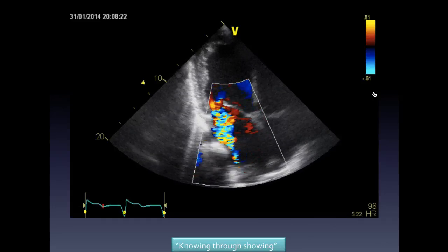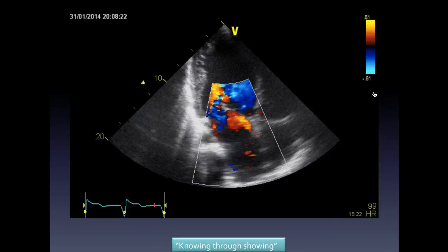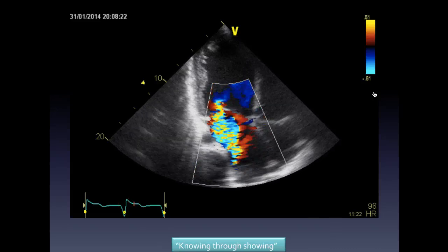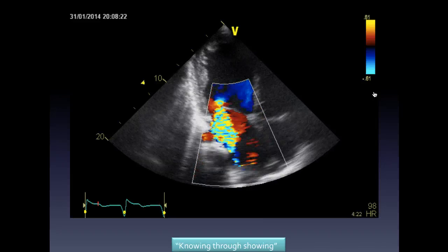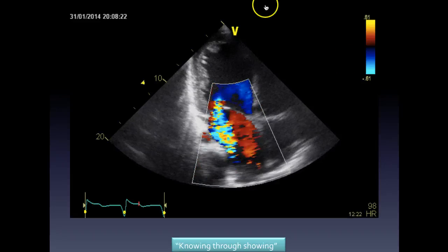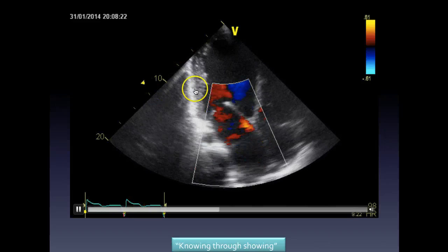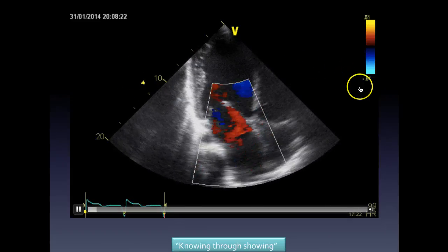And the pulse repetition frequency is generally set automatically by the machine based on the frequency of the transducer probe and, to a certain extent, the distance of the probe to the area of interest. And the area of interest here is correctly adjusted to being about 12 centimeters. Okay? If that was a TOE, the PRF would automatically adjust down to about 45.